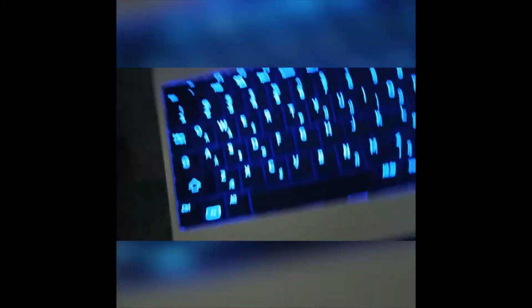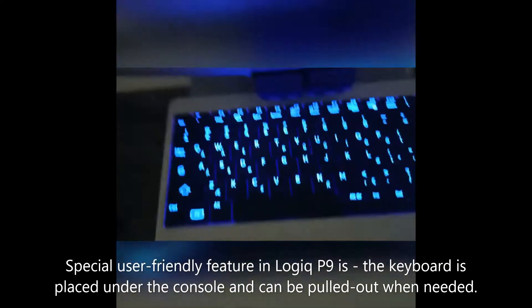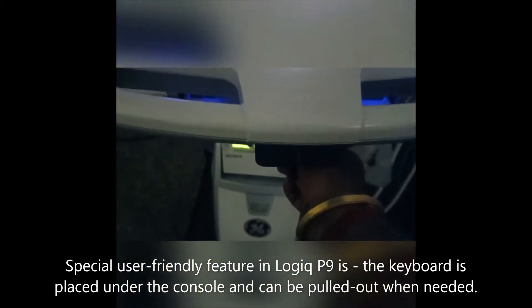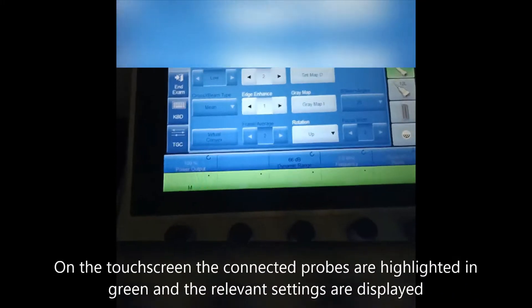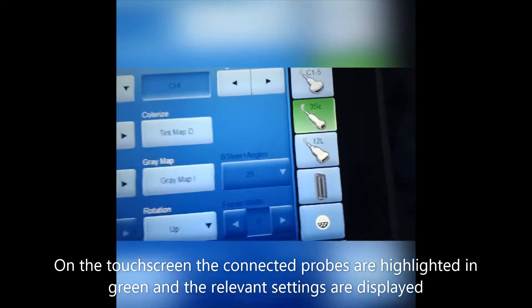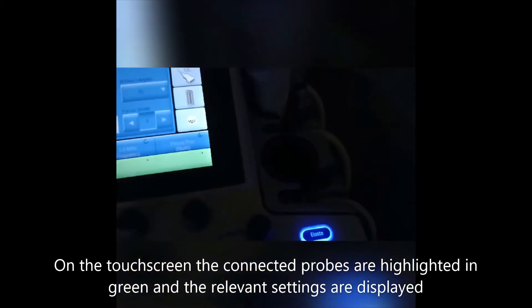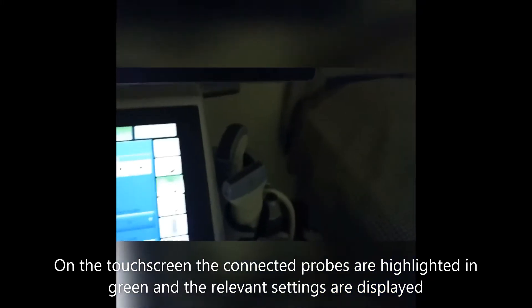In the Logic P9, a special feature is the alphanumeric keyboard placed under the console, which is very user-friendly for typing comments and distances. On the touchscreen, you can see which probes are connected — they will be highlighted in green — and those settings will be available on the touchscreen.